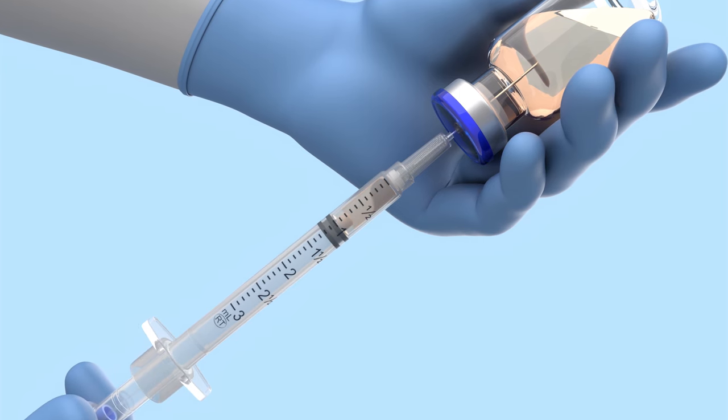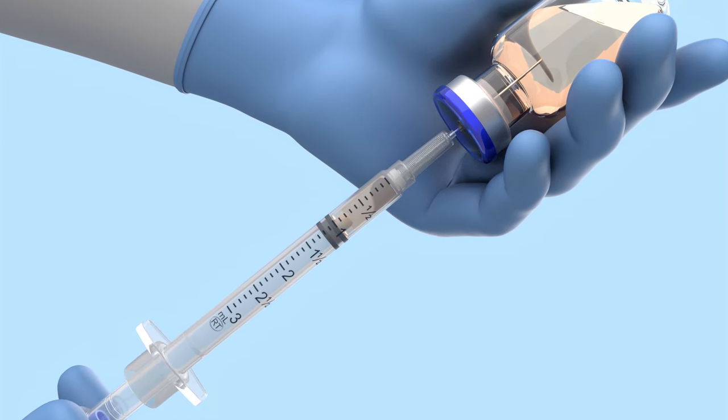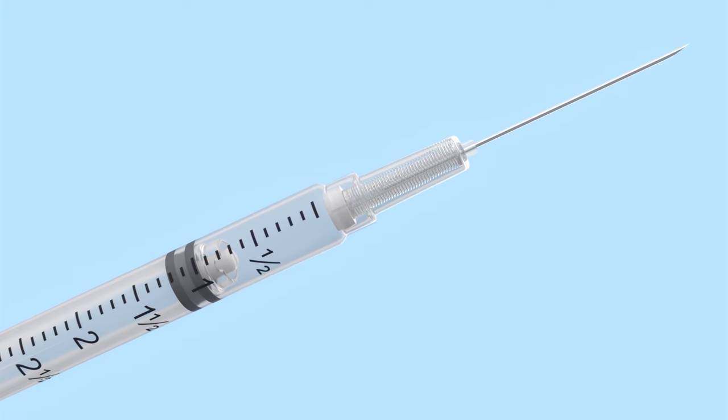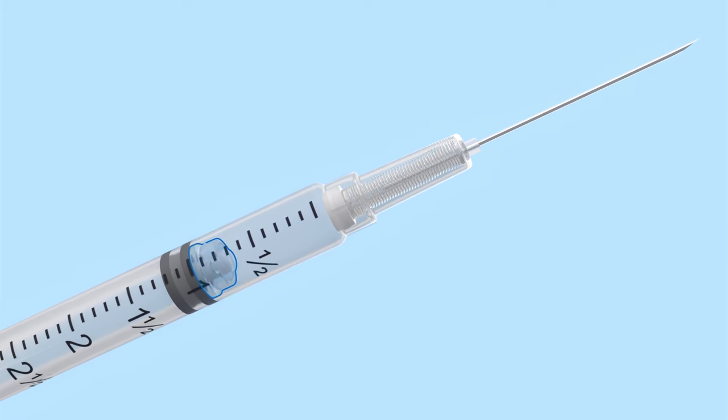Measure the dose using the leading edge of the black plunger seal. Vanish Point Syringes have been calibrated to account for the retraction mechanism on top of the plunger seal.